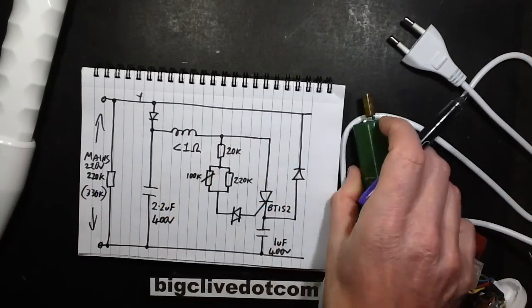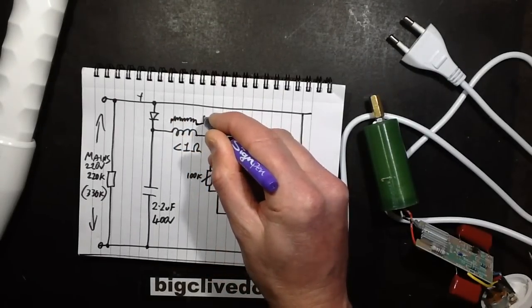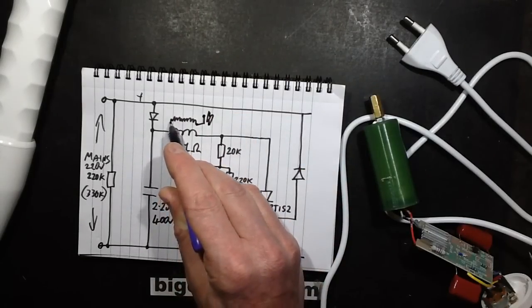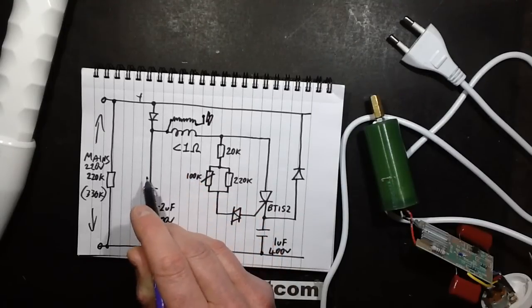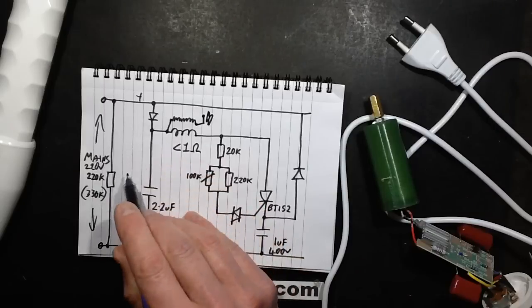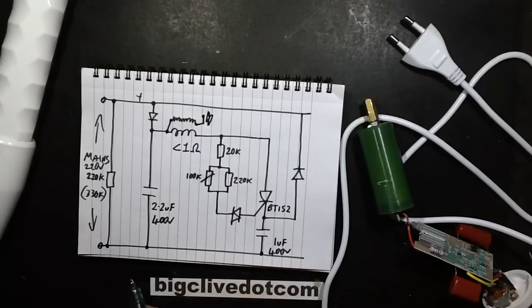This is just the primary of this coil. There's a very high number of turns in the secondary, and that's the output that's going to be the high voltage to the tube. I can't actually tell which end it's connected because this has such a low impedance, but I'm guessing it would be connected to this end, but it might not be. It could either be connected to that end or this end, but it's going to get its reference to ground somehow, and that's going to be what the high voltage is referenced to. But yeah, that's a simple circuit.